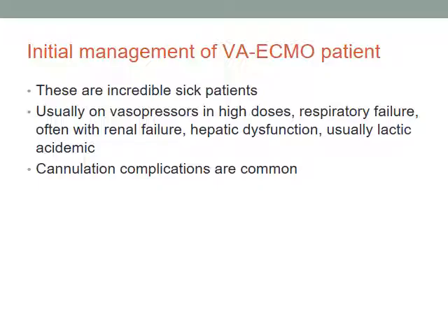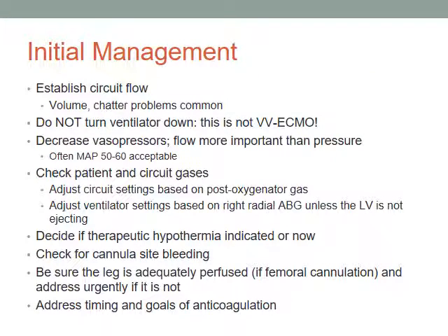Initial management, establish circuit flow. Often there are a lot of volume issues, you get chatter problems. This is a population of patients that are very challenging to manage. You don't need to turn the ventilator down if it's just pure VA ECMO. The lungs aren't the problem. So keep the ventilator settings the way they were.